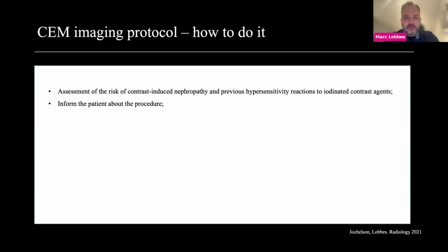We always tend to inform the patient about the procedure, not because the risk is very high, but it's a little bit different. Many women are used to getting a normal mammography, but when we all of a sudden decide to use an intravenous line and use contrast agents, and the whole procedure is sort of taken up a notch in difficulty, women could get a little bit anxious, and we just try to explain to them the reason why we're doing this additional examination and also what it entails so that they are prepared and they know what's going to happen. You place an IV catheter.